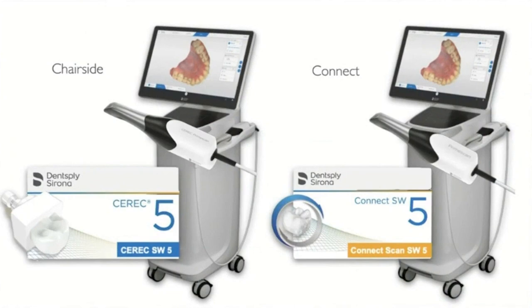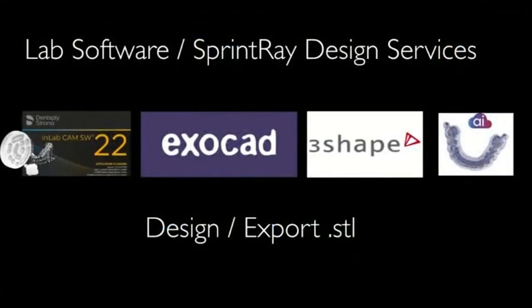Sorry. So in our office today, we actually have four scanners. Two of them are full scanners for chairside dentistry, and two of the other scanners are only to scan. Something that we've been implementing more and more in our office are the scanners that only scan, the intraorals, in the hygiene department, where we always scan our patients so we can see many problems the patient has, and we can explain it more easily. And also, having a full system in our office simplifies things.